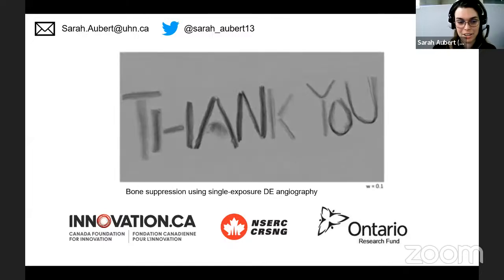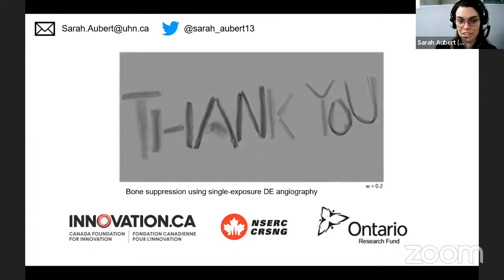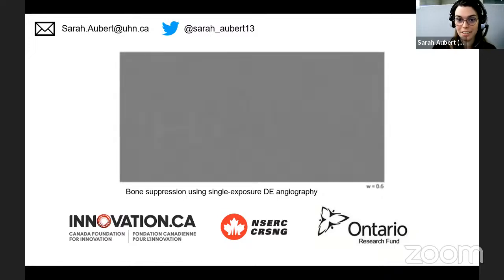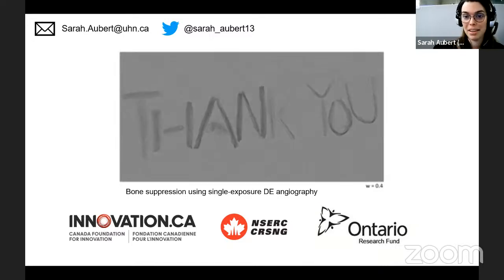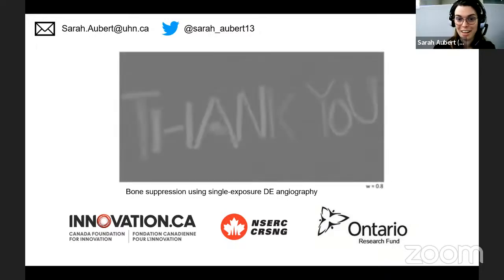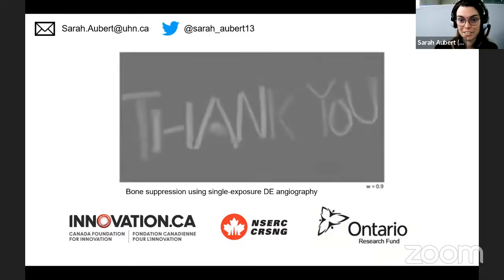Yeah, so I don't have the hard values of what the SDNRs are. But I think the line of logic is that the next step would be to compare the frequency content of the detector. Currently they use these energy integrating detectors, and they're well-known and the properties are well studied. So the noise power, the MTF and DQE are well understood. They're not currently well understood for these photon counting detectors in terms of their impact on image quality. So in order to compare them, that study has to be done first.